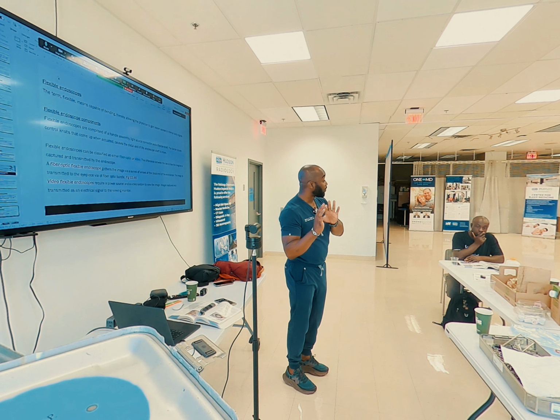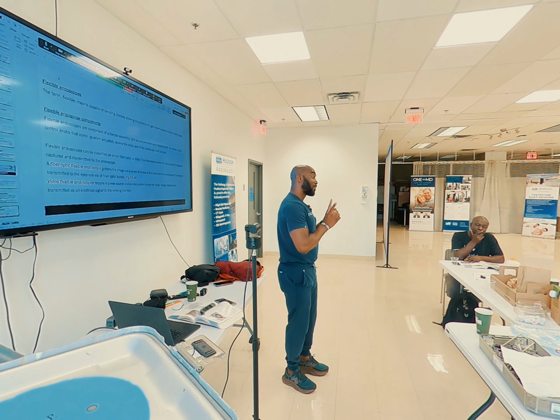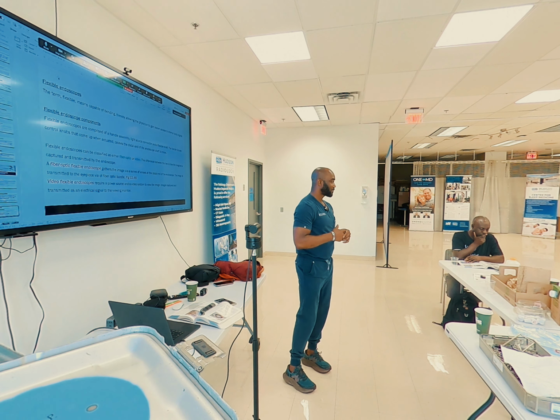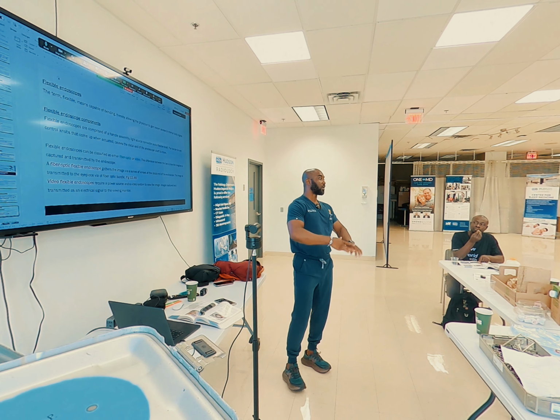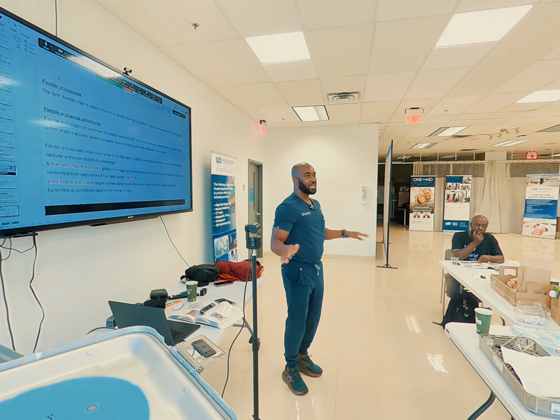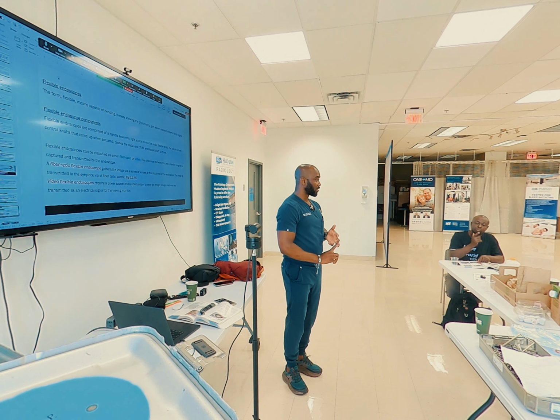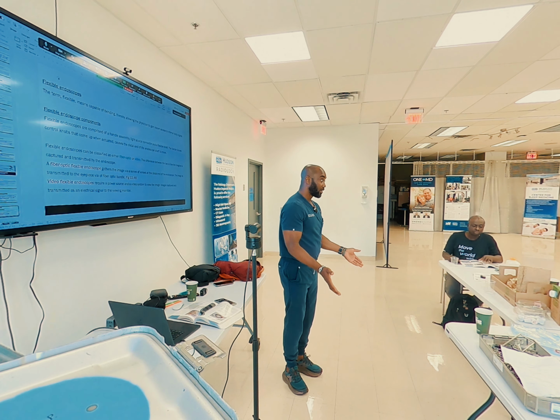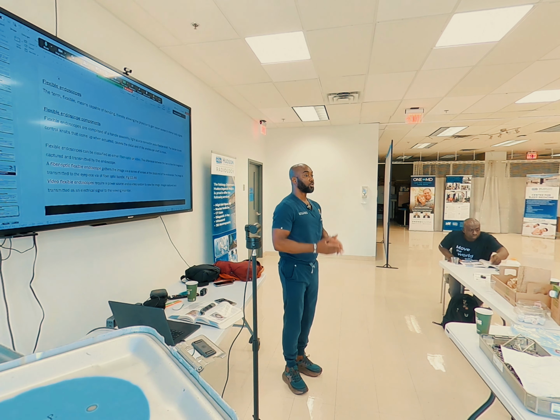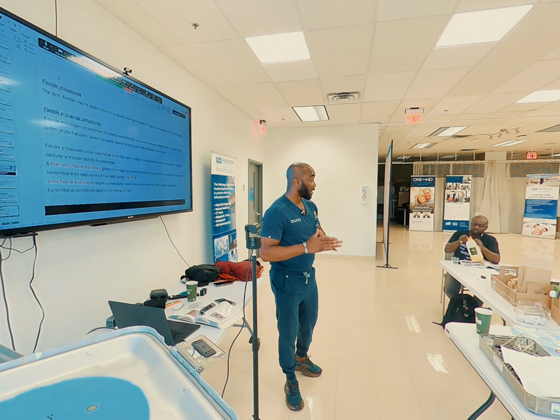You can perform manual low-level disinfection, not manual high-level disinfection. Do we understand this? Is it clear or is it confusing? So going forward, unless your hospital doesn't have any AER, then you can do high-level disinfection manually. But now it's required to only do high-level disinfection by automation.